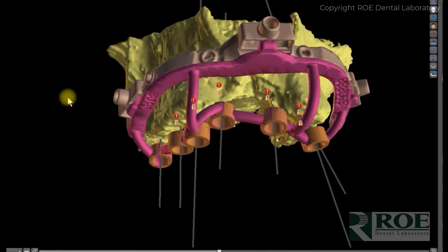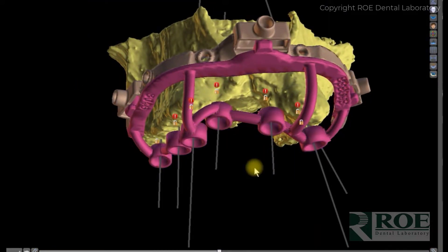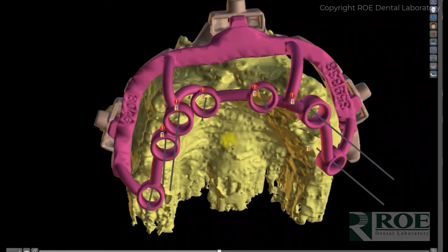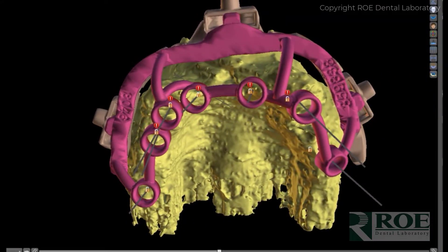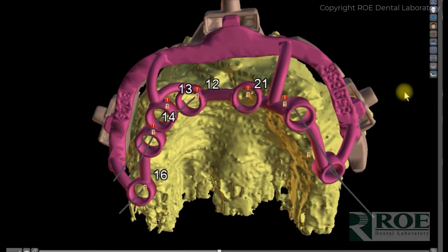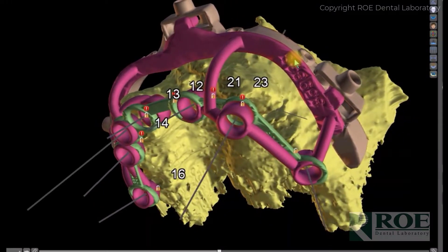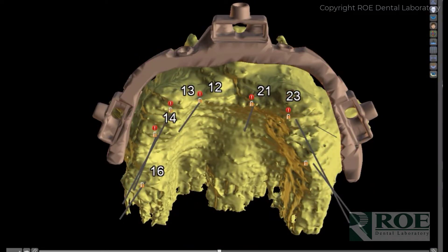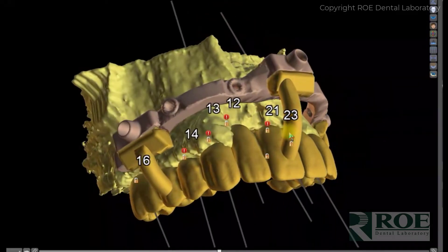In this case the osteotomy guide will go in after tooth extraction. We'll remove the teeth, turn off the cylinders, and the osteotomy guide goes in. Once the implants are placed, the osteotomy guide comes off. In this case there was one osteotomy guide, and then there's a reinforcement for the prosthetic, and then the prosthetic is loaded on the fixation base with three CAD-designed legs.